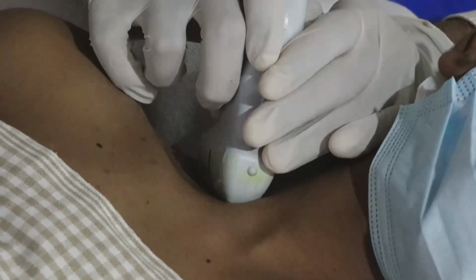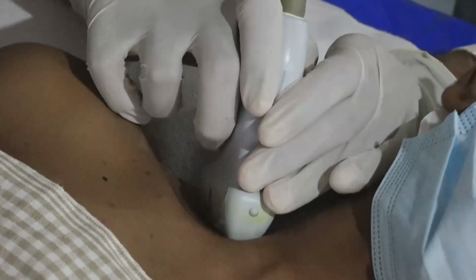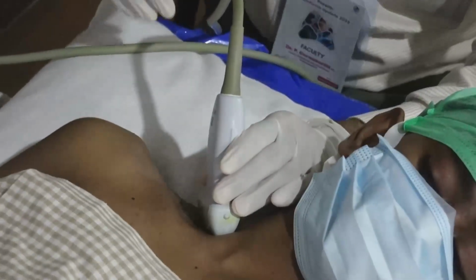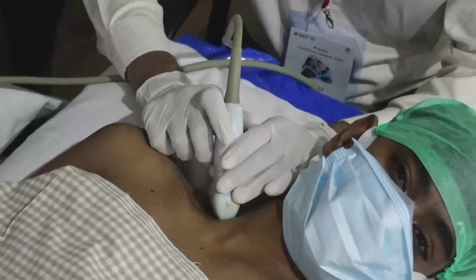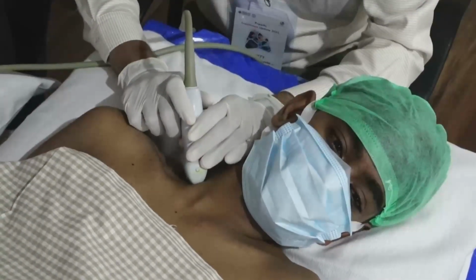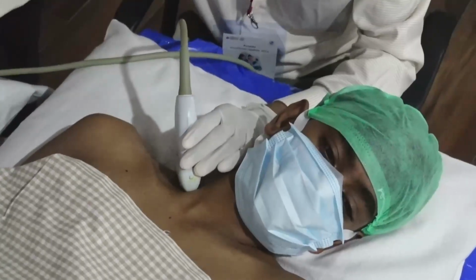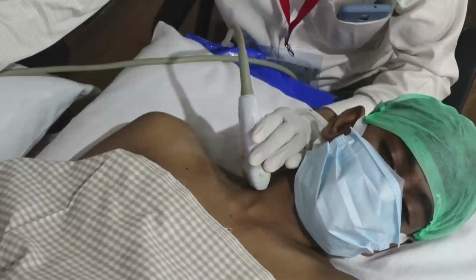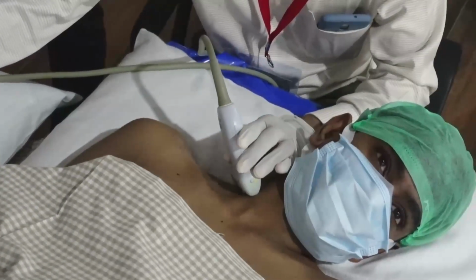So the idea of giving upper trunk block is to reduce the complication of phrenic nerve palsy. So we want to go away from the phrenic nerve. That is, if you give the block in this groove, why upper trunk?